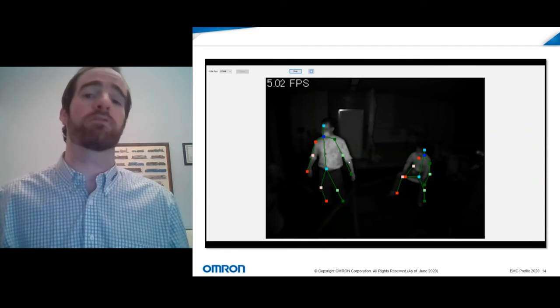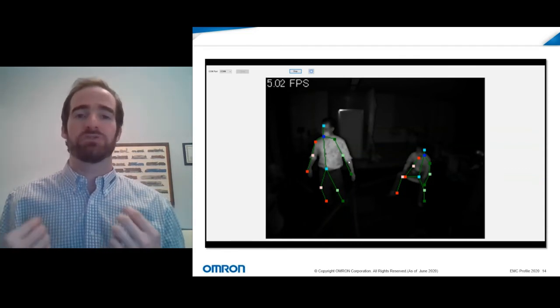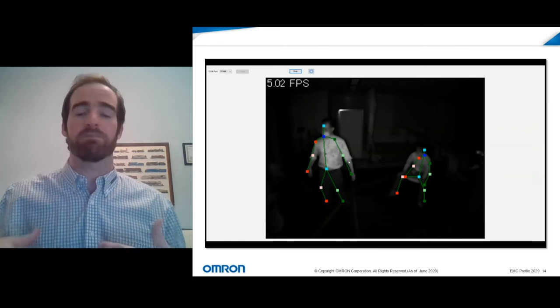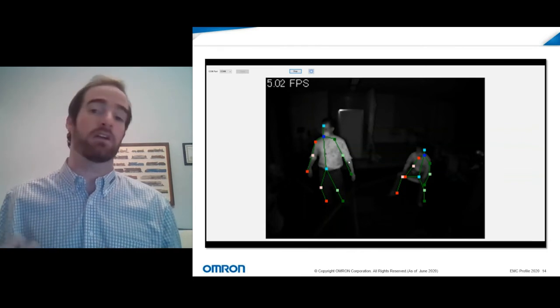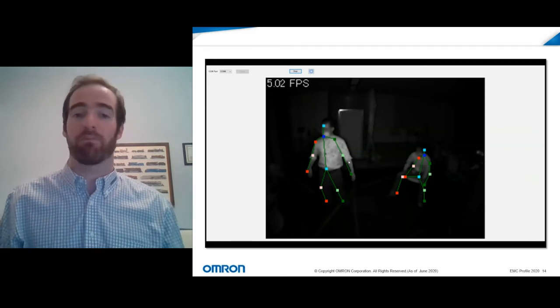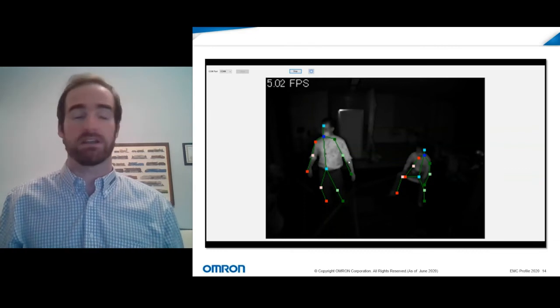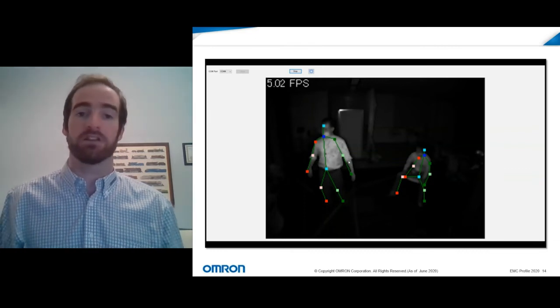It was important for customers, we found, to be able to read the presence of a human body even when they are not fully visible by the camera. There are certainly going to be ways that patients are going to be around the space and not always going to be fully visible, all arms and all legs, if they're walking behind pieces of furniture.